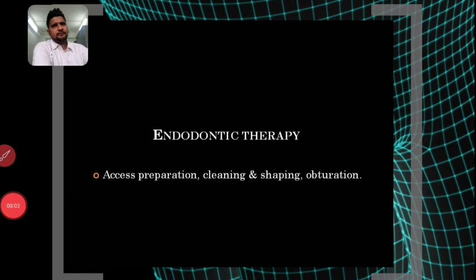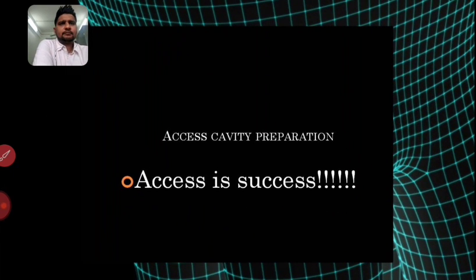Okay, so let's go to the first step of endodontic therapy, which is access cavity preparation. Now, according to me, access is success. If you have done a good opening in the coronal portion of the tooth, which we call a coronal cavity or an access cavity or an endodontic access opening, and you have made the right access to the root canals, that determines all of your success.